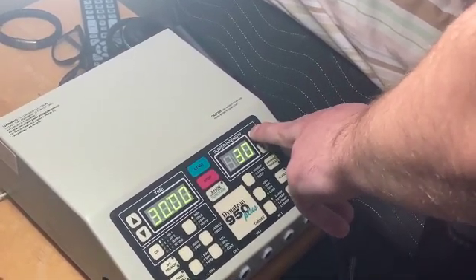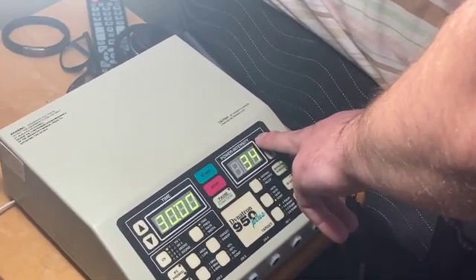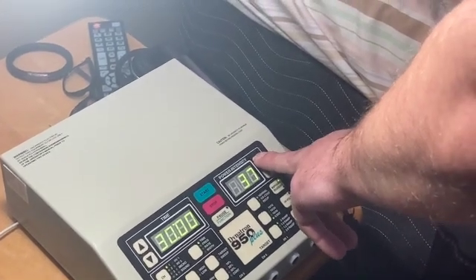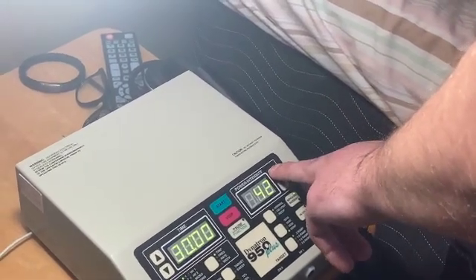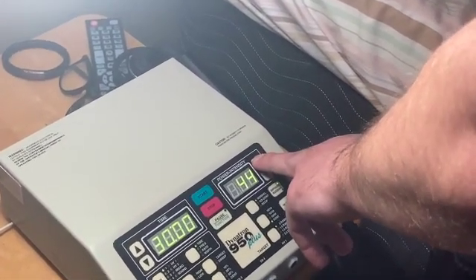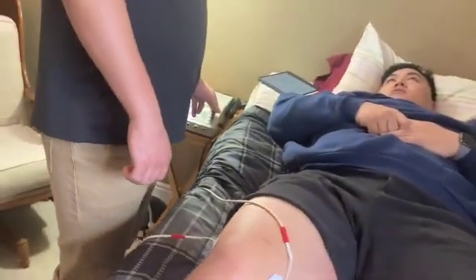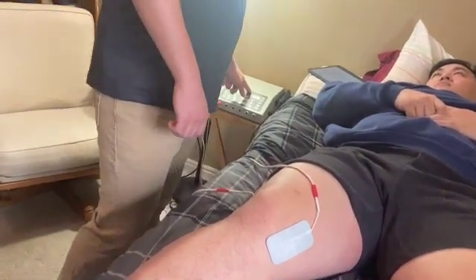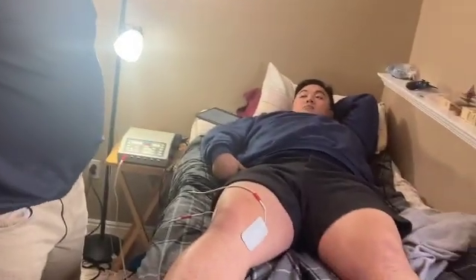Okay, you can feel a tingle. A little tingle? All right, we'll go a little slower then. And keep going. All right. Just remember, if you feel your muscles start to go, that's when you want to stop it. Right there? All right. So then we'll start the program. And that still just feels like a gentle tingle for you? It's a tingle with no muscle. Like a strong tingle? All right. Feels good. Sounds good. It feels good? Yeah. All right.